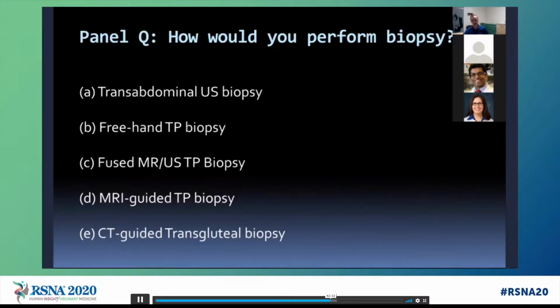Yeah, and as you say, we've run into this difficulty. These come along like buses. You do 2 or 3 in a month period, and then you don't do another one for a year. On average, we probably do about 2 a year of these. We have had success more recently in doing this fused approach, but as you say, you get a coronal view and a sagittal view rather than an axial view. When you're coming from the perineum and scanning, you can't get an axial view. And that can be a problem for some of the fusion software that's set up for an axial fusion. We did a lot of these, and this particular case as well, with a freehand approach.